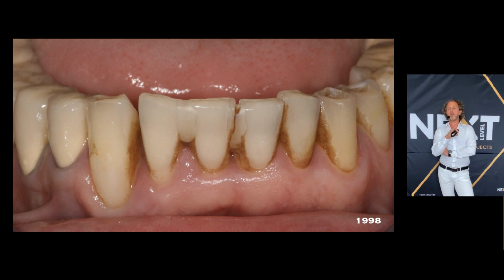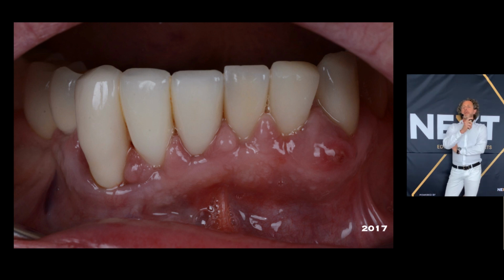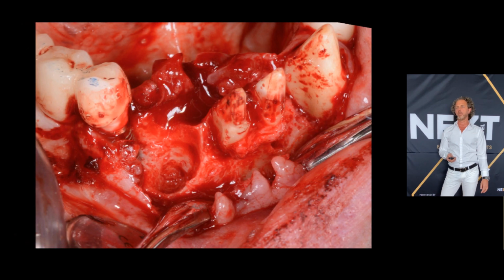I know this patient from 1998, so it's almost 30 years ago, but I met him 2 years ago with this situation. Just look at this horrible tissue situation. We have multiple abscess, huge tissue loss, bone loss, and when I remove the hopeless canine on the right, even the threads of the adjacent implant is visible.